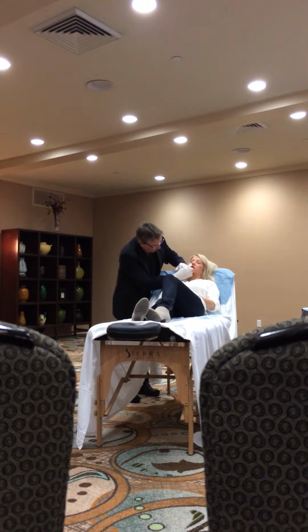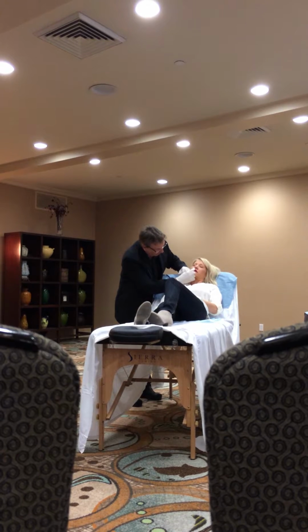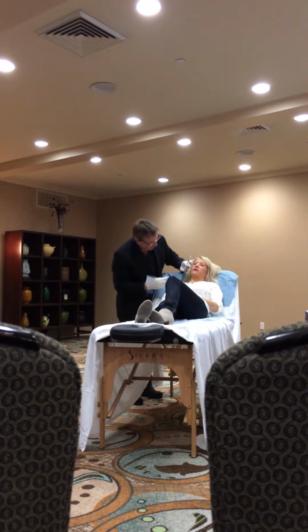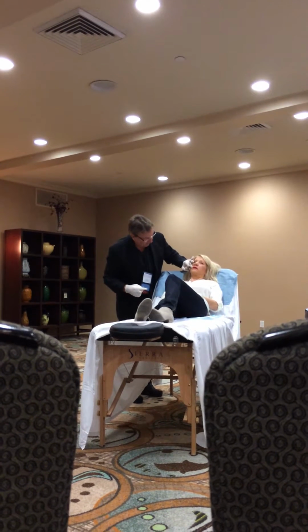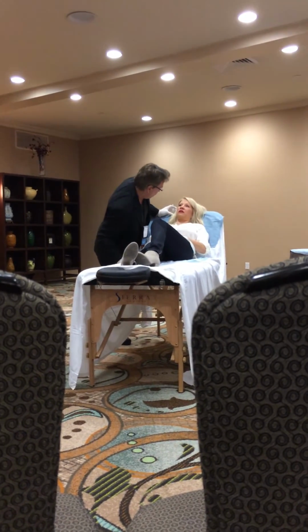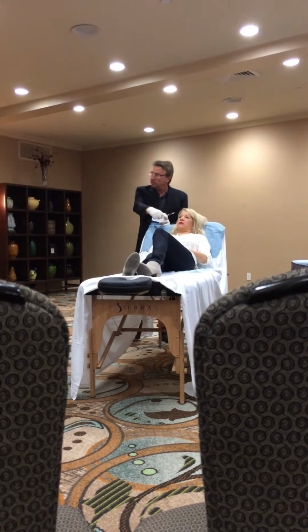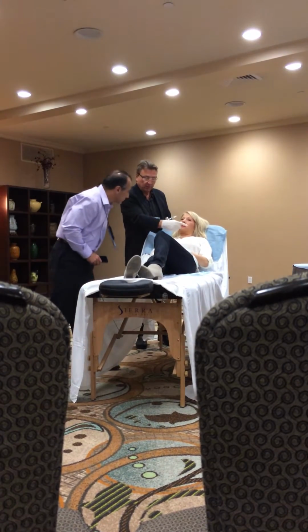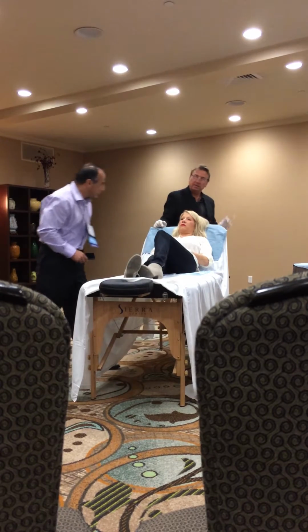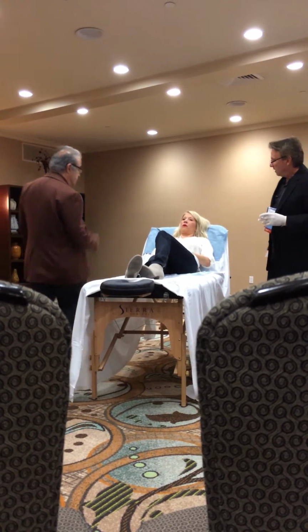Come from this direction, it's got a little lipstick on it. And I go right up here and I go relatively superficially, and I inject just like that. And it tends to pop it out like this a little bit. Now, once... That is the weirdest feeling in the world. If you want to look at that, you can tell if you see a difference now of this one and this one. It's a nice, subtle little improvement.